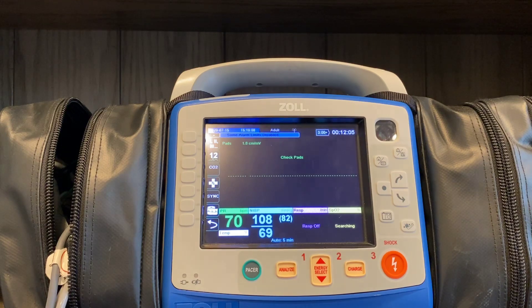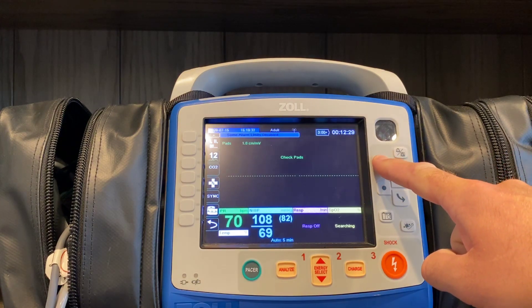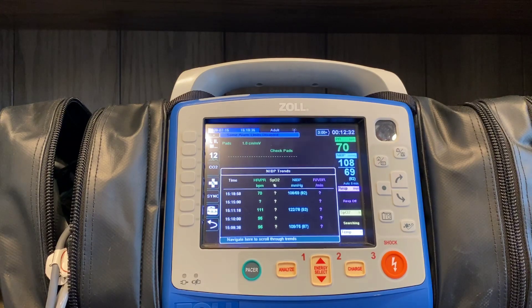The last thing to cover on the X-Series when it comes to blood pressure is the trending data it collects. Every five minutes, the X-Series will automatically record all of the vitals currently running on the screen and trend those over the course of the call. That information will also be available to upload into your EPCR vendor's platform. To access those during the call, hit the home button and you'll see a window that says NIBP Trends. Every five minutes, or anytime there's an intervention with the patient, the information on screen will be stored in the machine's memory and made available to send to your EPCR platform.